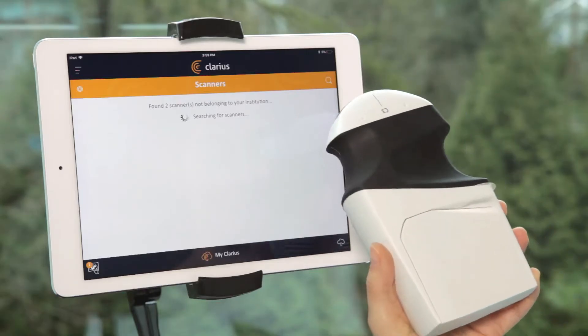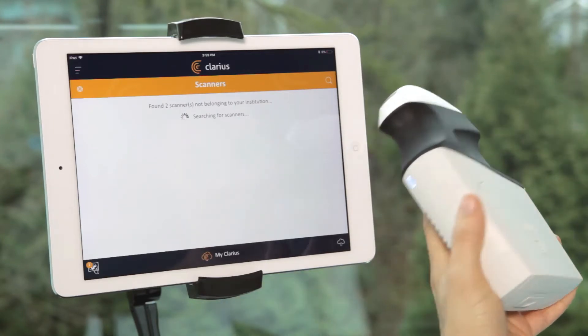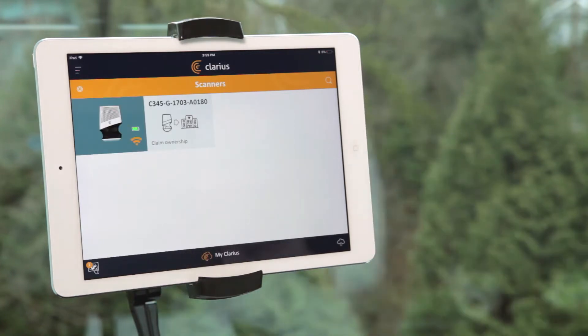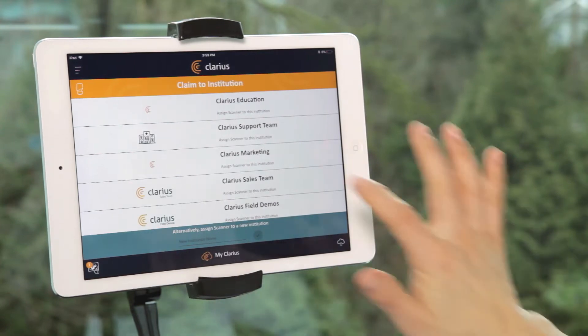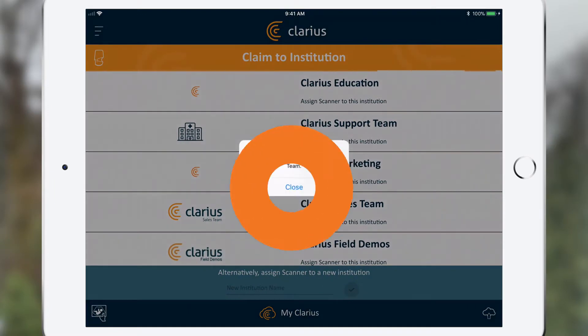Remove the battery saver tab to boot up the scanner. The scanner light will flash blue, then green, and you'll see it as claimable in your app. Once you click to claim your scanner, the app will prompt you to create a new institution or select an institution that is already connected to your account. Click to select your scanner when it appears on your list.